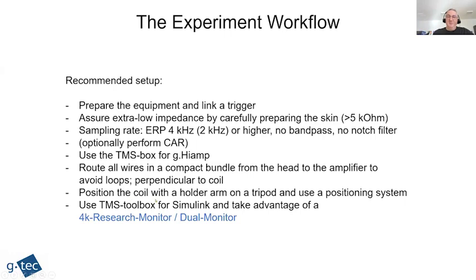Then we should position the coil on the holder arm or the tripod or some other support, and we should preferably use the neuronavigation system so we can position the stimulus as accurately as possible. We unfortunately do not have time for that today.